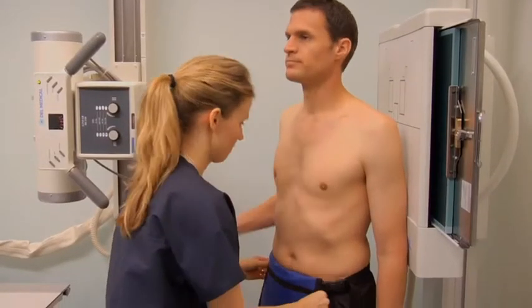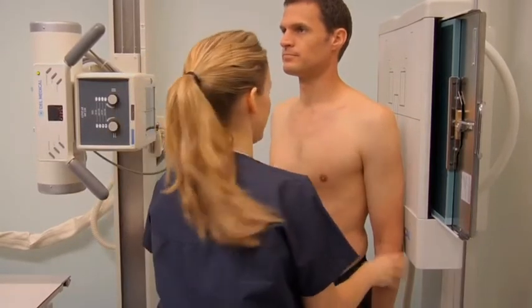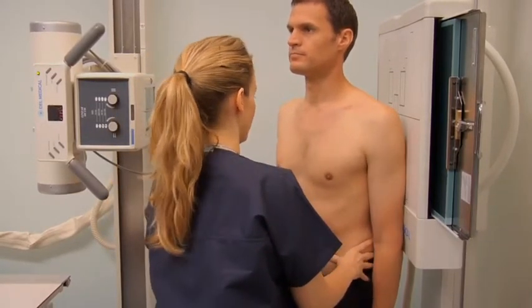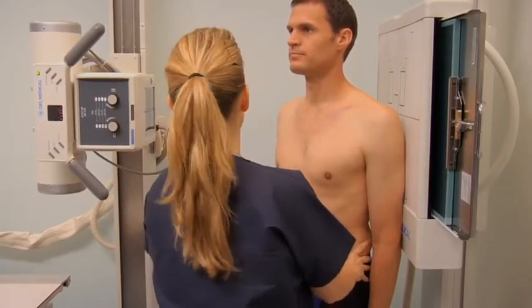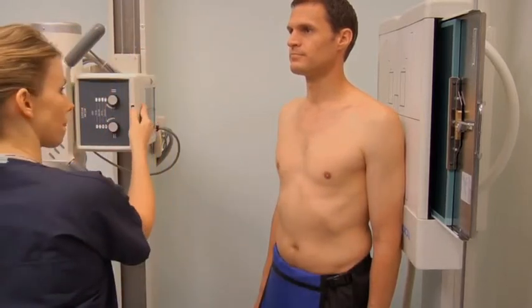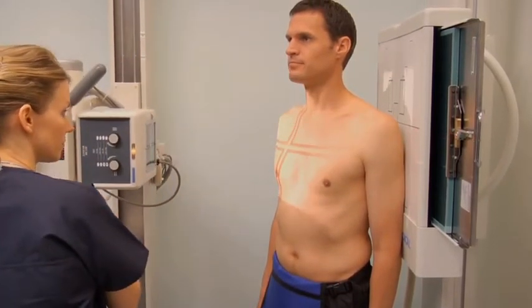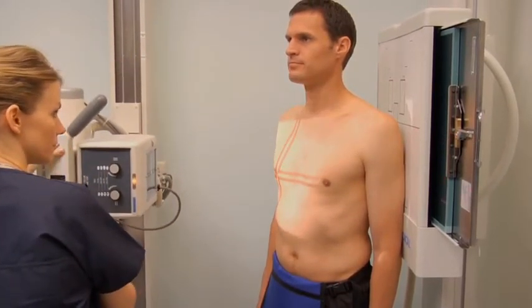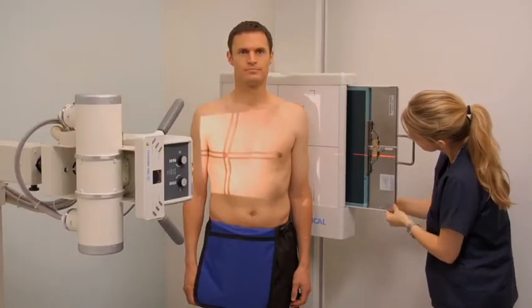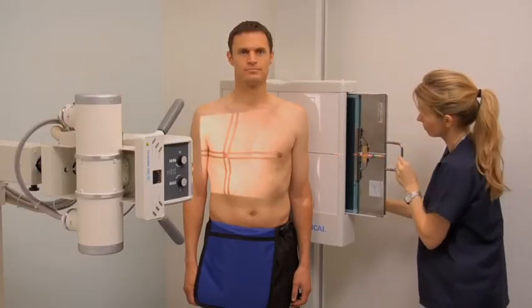Adjust the lead shield and rotate the right side of the patient's body 45 degrees away from the image receptor. Align the central ray to the level of the 7th thoracic vertebra and midway between the mid-sagittal plane and the lateral border of the right-hand side.